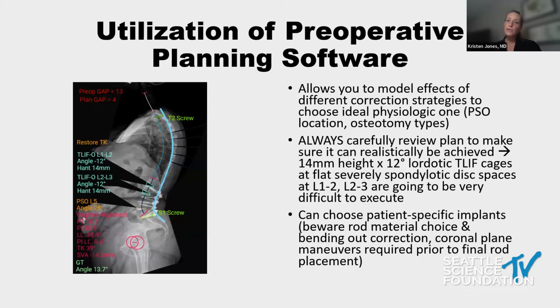As far as how to plan surgery, I believe we're going to have another talk about this, so I won't go into too much detail, but I just wanted to point out some of the weaknesses that exist in preoperative planning software, because I think it's really great to use, and I use it all the time, but I think it's important to recognize its current limitations.